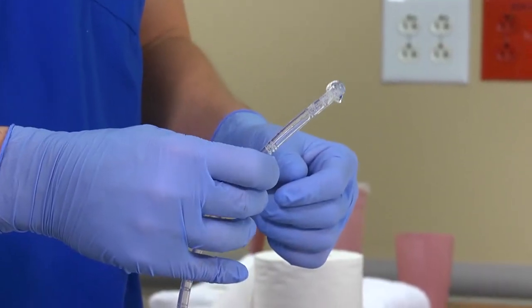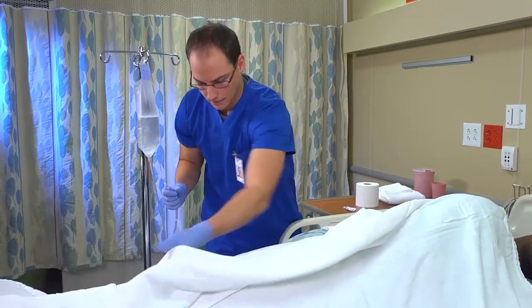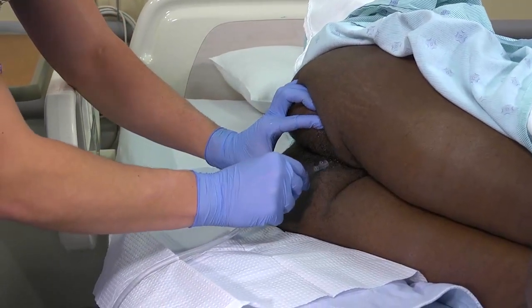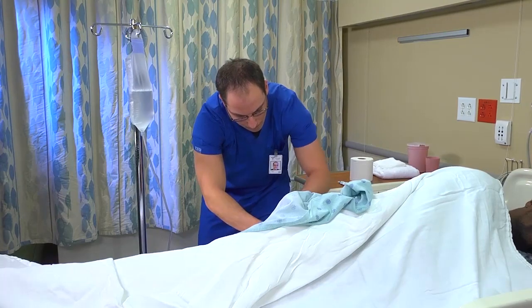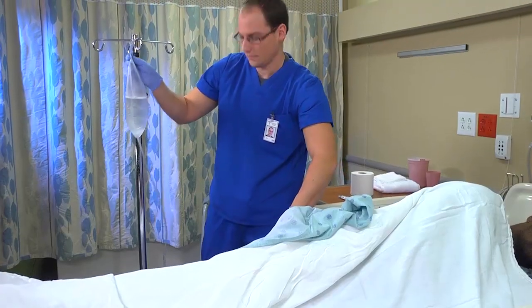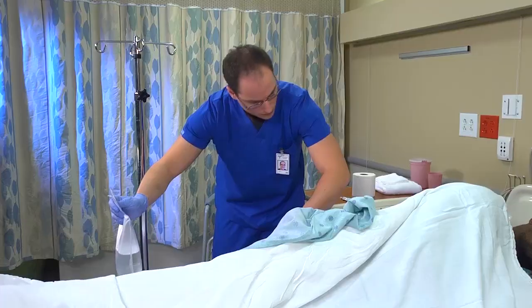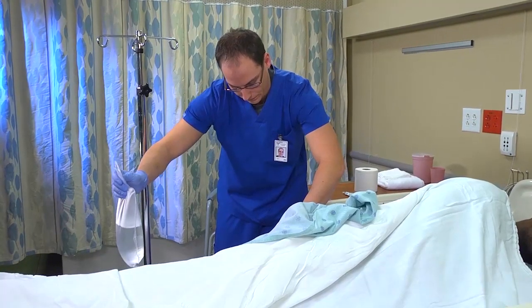Then gently separate the patient's buttocks and locate the anus. You can help him relax by reminding him to take deep, slow breaths through his mouth. Can you take a few deep, slow breaths through your mouth? Touch the skin next to the patient's anus with the tip of the rectal tube. Then gradually insert it into the anal canal, angling it toward the patient's umbilicus. As you would for a pre-packaged enema, adjust the insertion depth based on the patient's age, but don't force it.